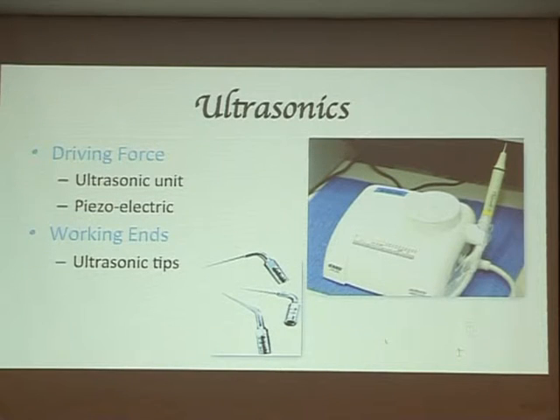Endosonics, okay, we use a lot of endosonics. I'm not saying you must use endosonics for your whole endo cases, but I just show you what it can do for us. We need a driving force. It's a normal ultrasonic scaler, okay?